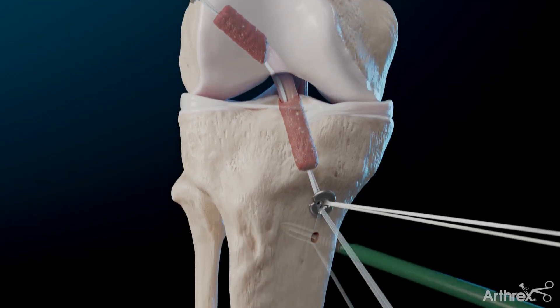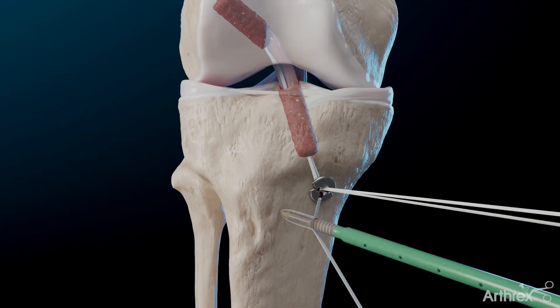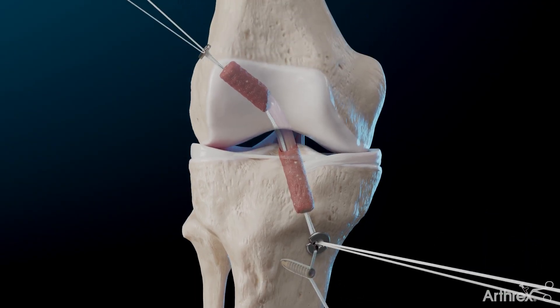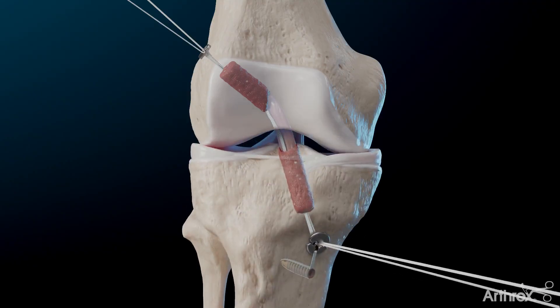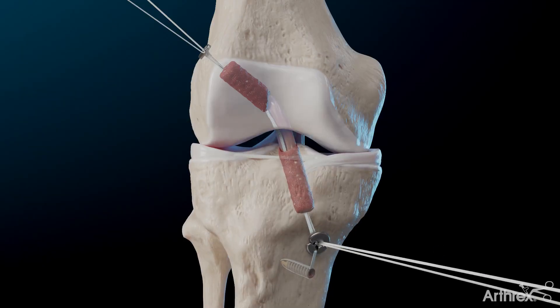Fully seat the quad-link ACL graft into both femoral and tibial tunnels. Complete internal brace final fixation in full extension. After cycling the knee several times, complete femoral and tibial tightrope final tensioning.